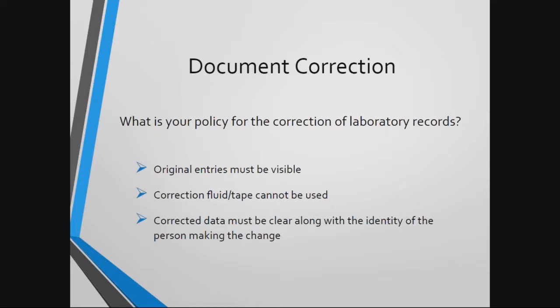Original entries must be visible. Correction tape or fluid cannot be used. And the corrected data must be clear along with the identity of the person making that change.